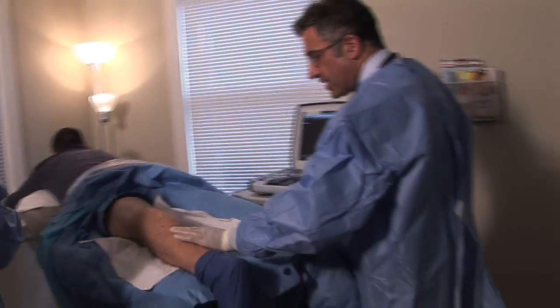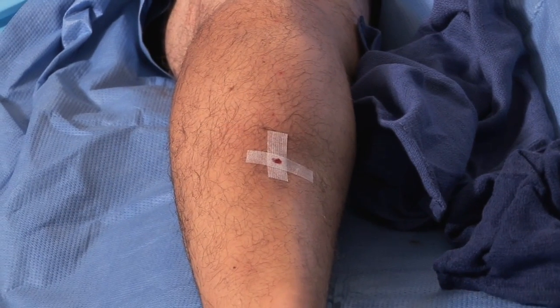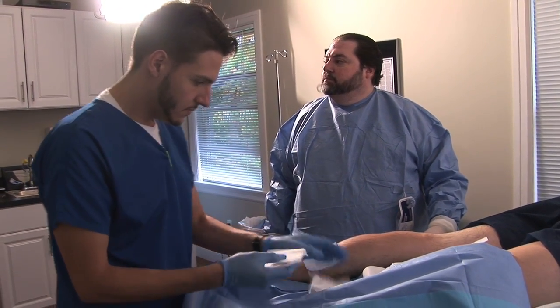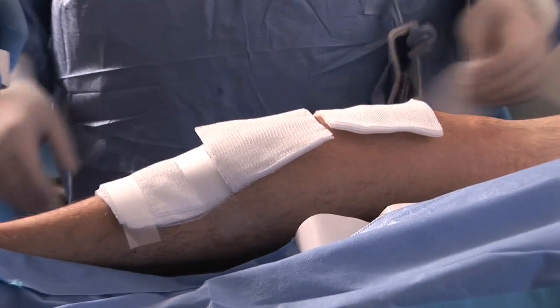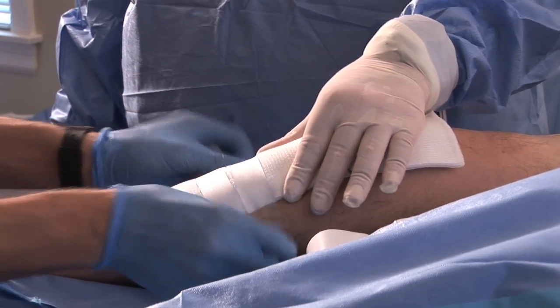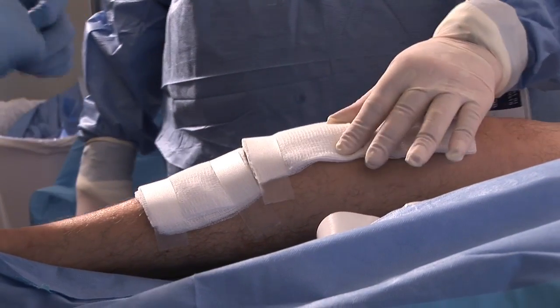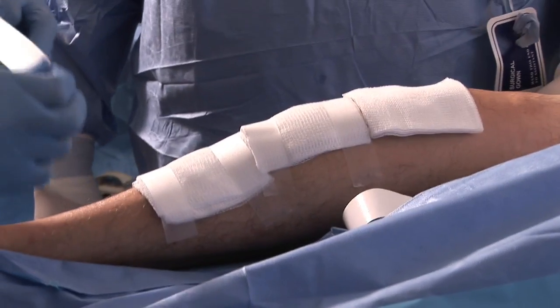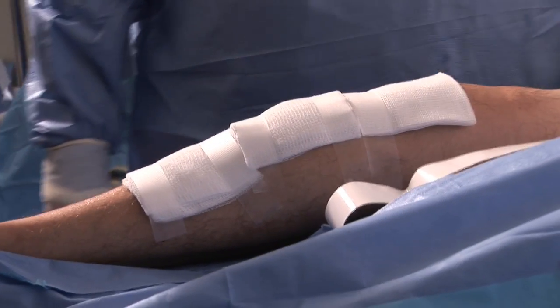No pain, no discomfort, no time off their feet, no time away from any activities of daily living after the procedure. Gauze is placed on the very tiny needle holes that we made while injecting anesthesia, because if that's not done then the fluid can ooze out and soak the patient's stocking — it's just an inconvenience. These gauze are removed after about an hour, because in about one to three hours all the fluid injected inside the leg has been reabsorbed and excreted through urine without any problems at all.